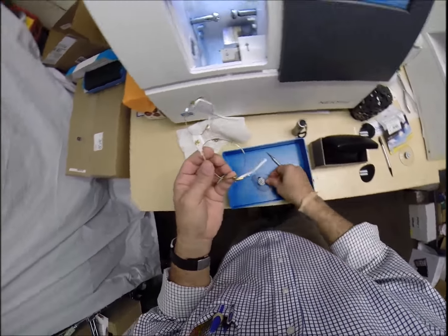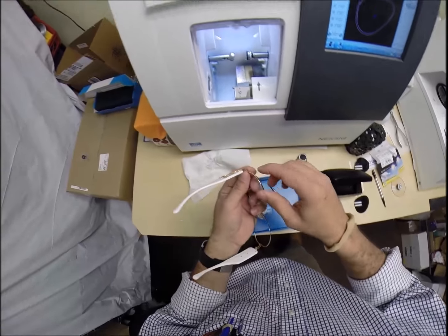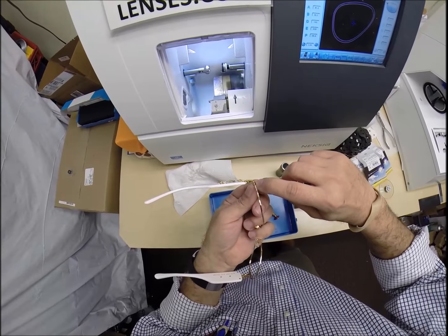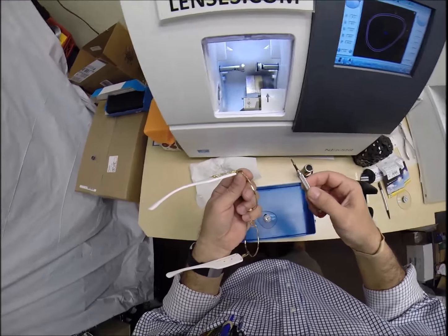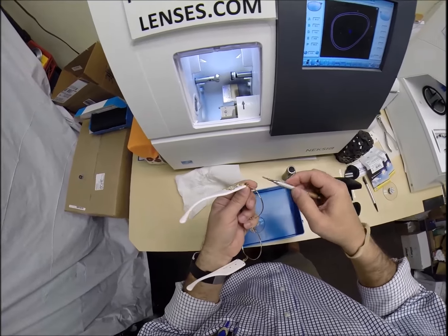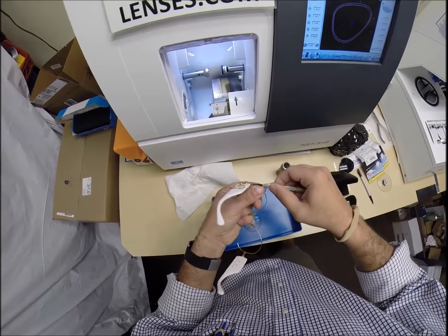So if anyone else needs to ever change the lenses in a frame like this, in a metal frame, this one actually requires a Phillips head screwdriver, just a small Phillips head. But some frames need a flathead. But for what I do for metal frames, I loosen them. Now I could take it all the way out, but I don't want to do that.